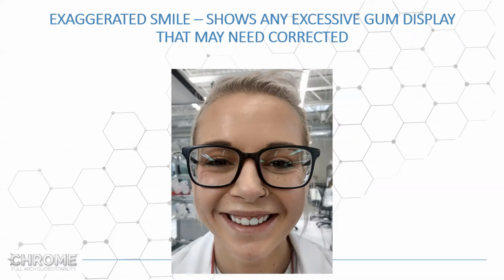And I think everybody here should probably understand what a transition line is, or a problem with transition lines, but I have a picture of one to show you. We have developed a formula that addresses the gummy smile, and so far has worked very nicely with getting these cases completed without having transition line issues.